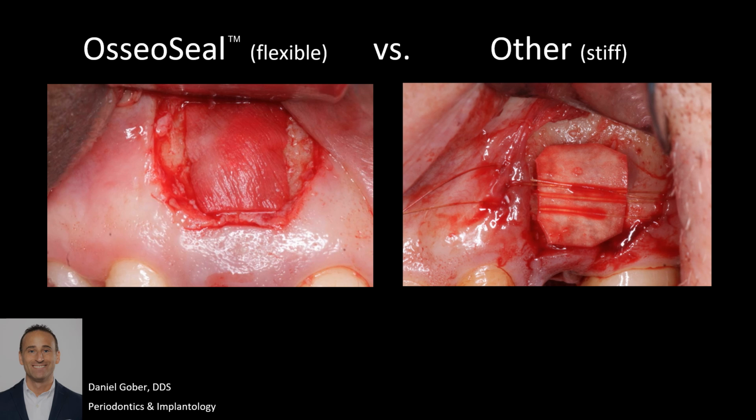So this is one of the ways that I've come to appreciate the value of using OsseoSeal when repairing these kinds of fenestration defects, and something that I think is important to keep in mind when selecting membranes in general.